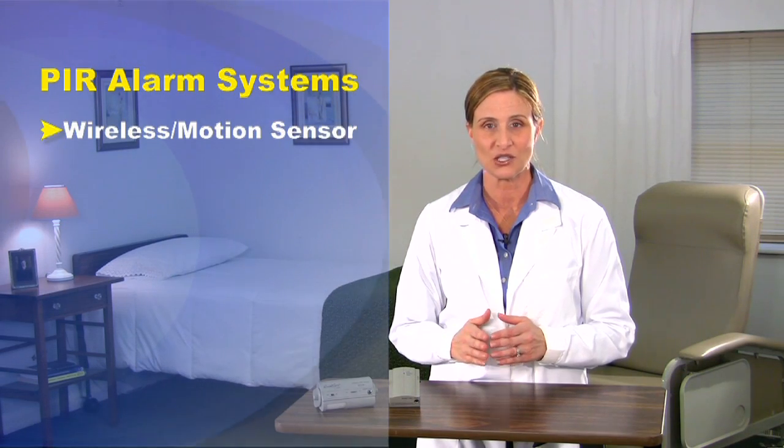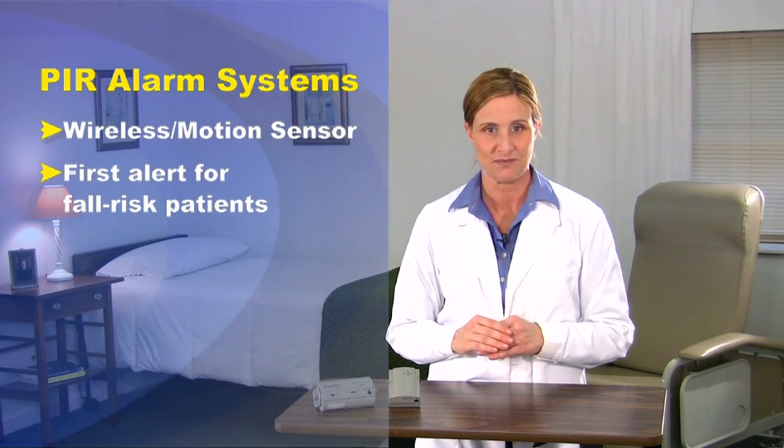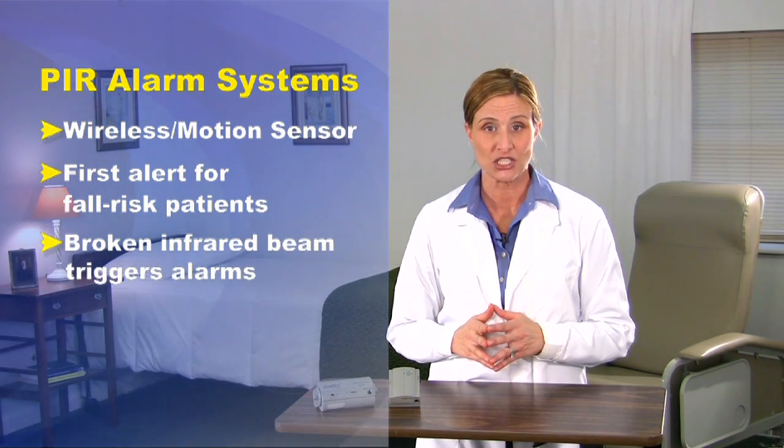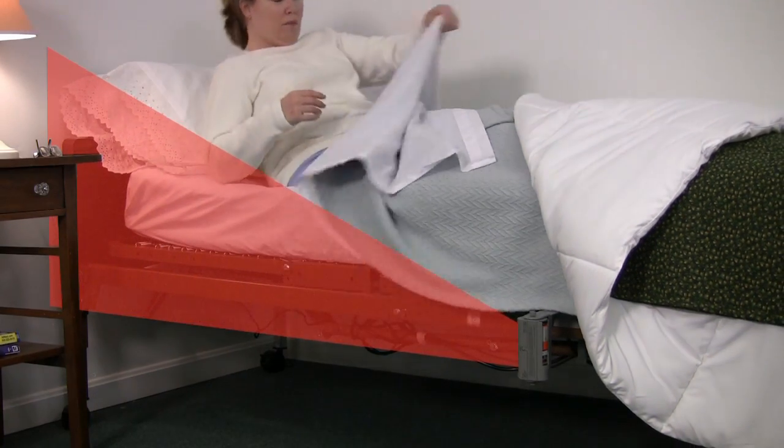But just to quickly review, the PIR is a wireless motion sensing alarm that acts as a first alert to patients who are about to rise from their bed. It uses infrared technology to create an invisible field that triggers an alarm once the sensing field has been disturbed.